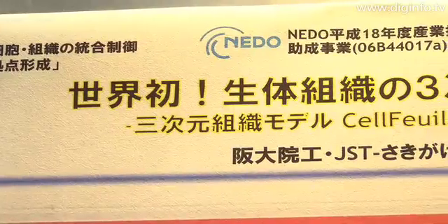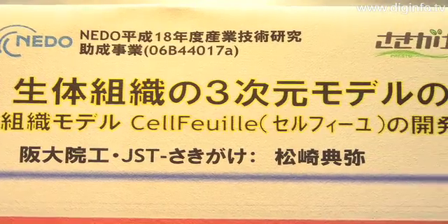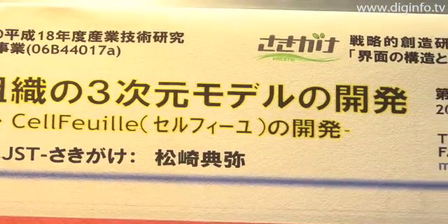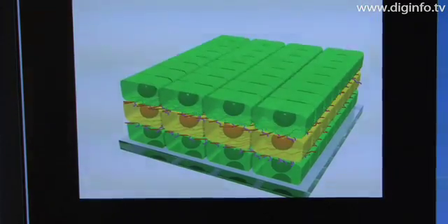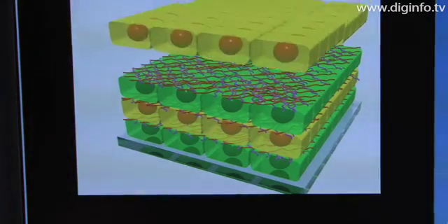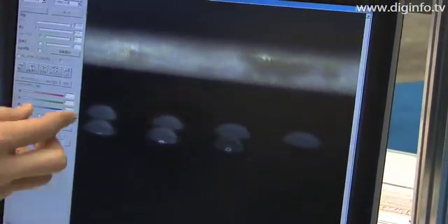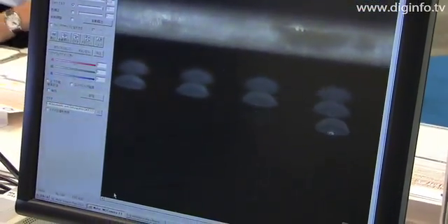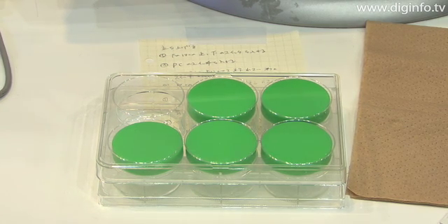With support from NEDO, Osaka University's Dr. Matsusaki has studied adhesion of cells to the surfaces of single-layer cultures. He developed technology for forming a membrane of fibronectin and gelatin to control cell adhesion and create a 3D structure by repeatedly growing another layer of cells on top of the first one. The development of equipment for this project was commissioned from Cluster Technology Company and Sumitomo Bakelite Company, which manufactures a stratified culture kit called Cell Fuya.